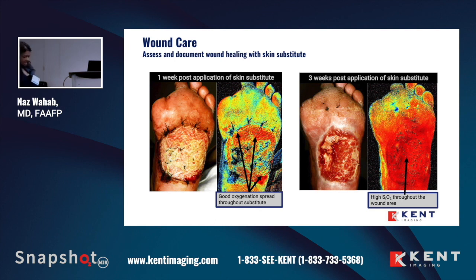Here too, you can really pinpoint, and again, we didn't have a lot of the percentages of oxygenation on here because it kind of clouds the picture and it's very difficult to evaluate. But if you just look at the colors alone, you can see here that there's better oxygenation than in these areas. And then once the graft was more incorporated, we really got a much better outcome.